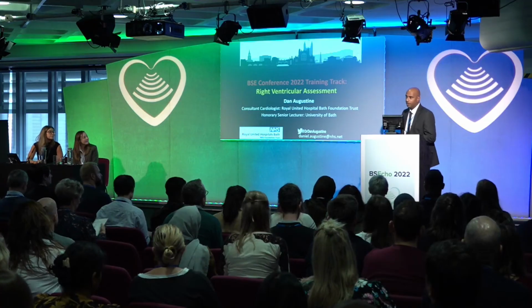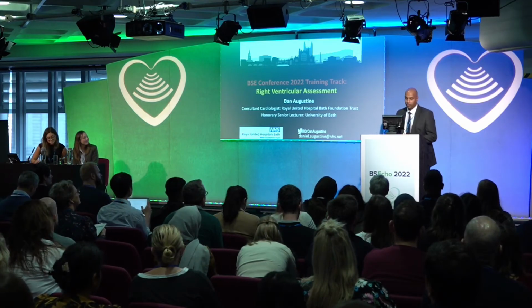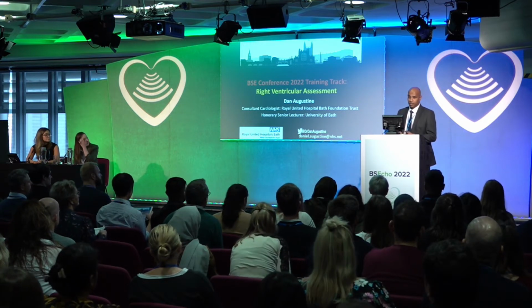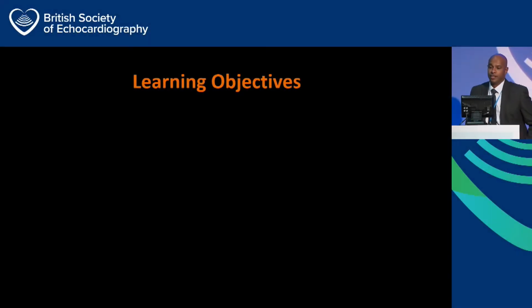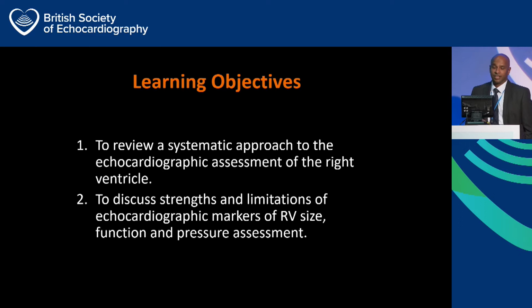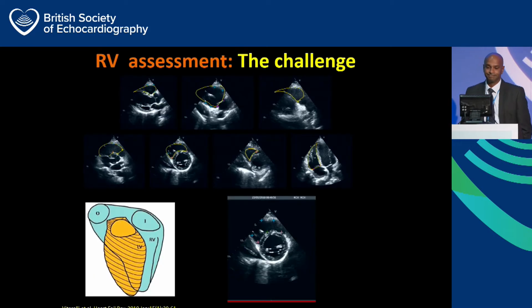Thank you very much, Evie, and thank you, Maria and Evie, for chairing this session. It's great to see so many people attending these training track talks, which are an integral part of our conference this year. Over the next 25 minutes or so, we'll be reviewing a systematic approach to the assessment of right ventricular function. We'll discuss strengths and limitations of echocardiographic markers of RV size, function, and pressure assessment.